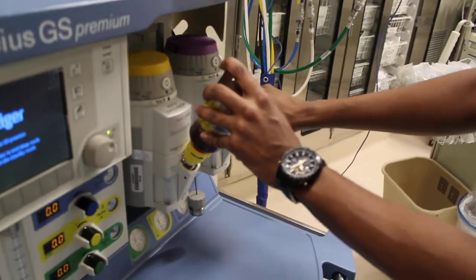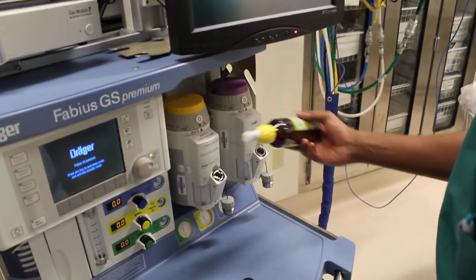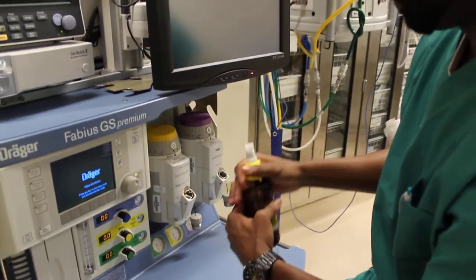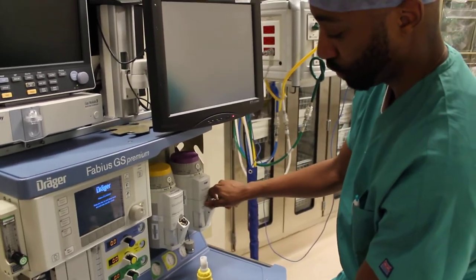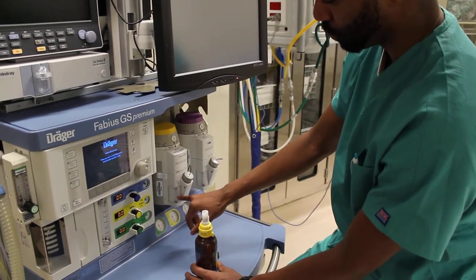Now I am going to show you how this key does not work with the isoflurane — it will not go in. Neither will this cap work on top of the gas container for the isoflurane. So make sure you have the right key, make sure you have the right gas, and make sure you get your levels rising when you're filling up.